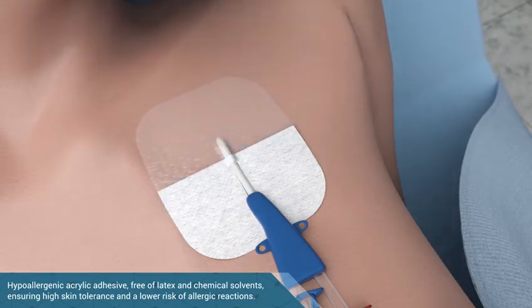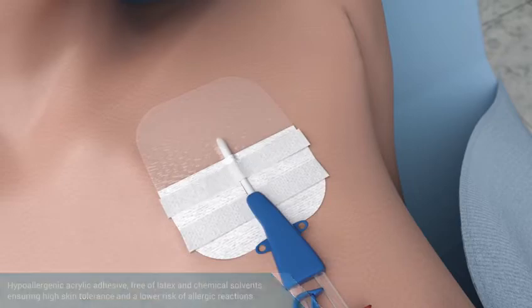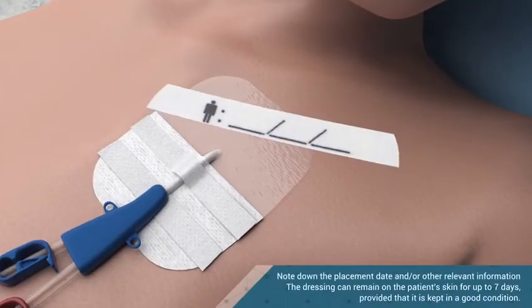The combination of its strong adhesion, the notched area that is reinforced with non-woven fabric, and the two fixing strips ensures excellent fixation.